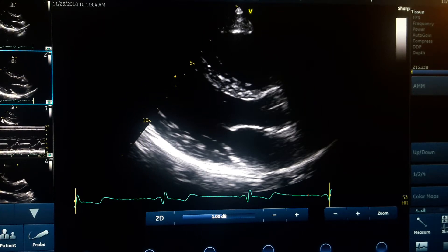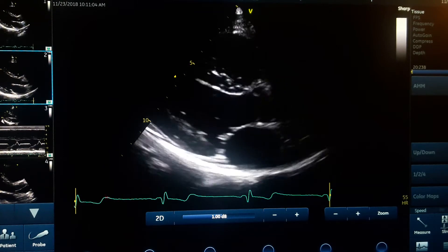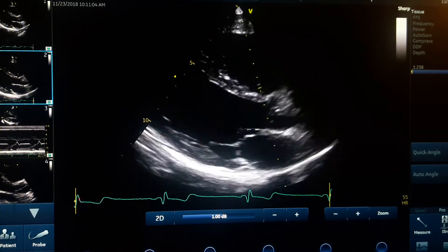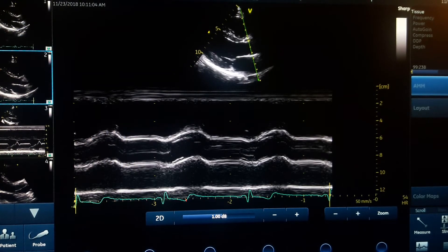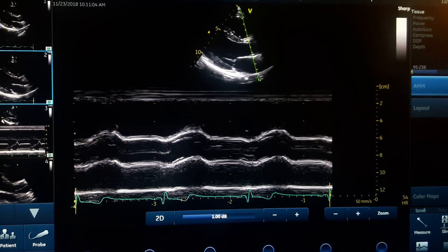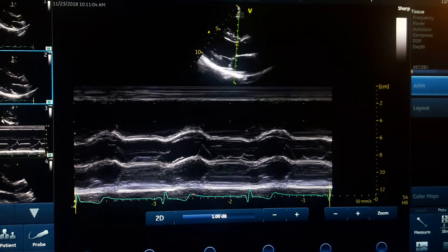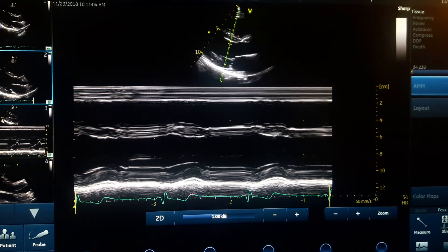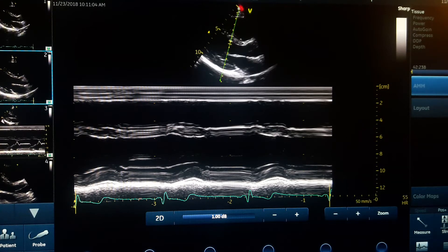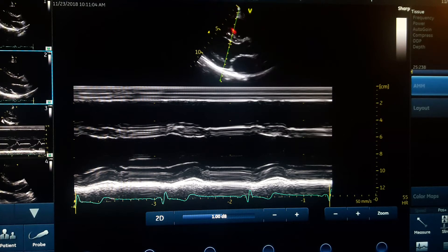M-mode creates an image from one line every moment — only one line every moment. For example, here is an aortic valve, here is a mitral valve, and here is the left ventricular. That line is the cursor. Wherever we put the cursor, the machine creates a picture from that line only, but every moment.